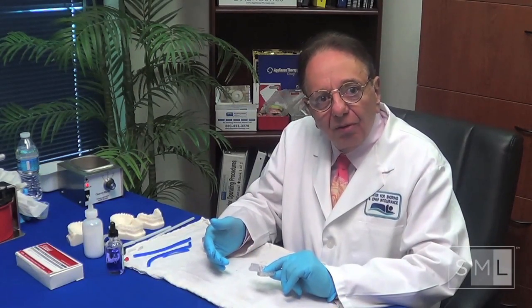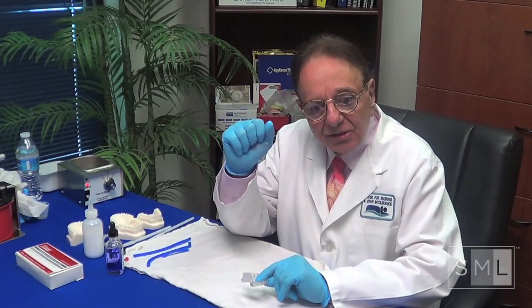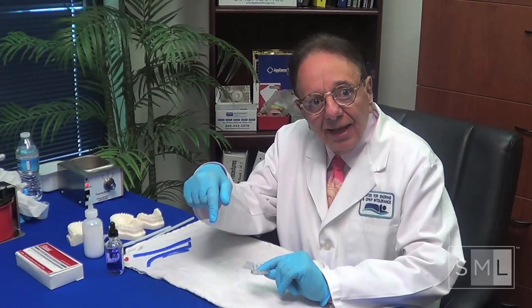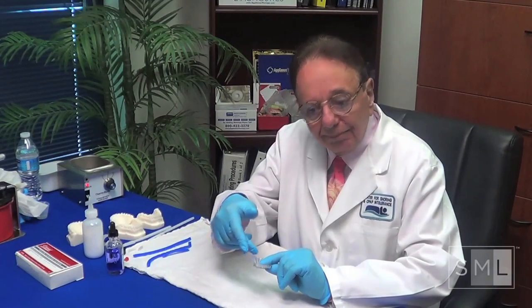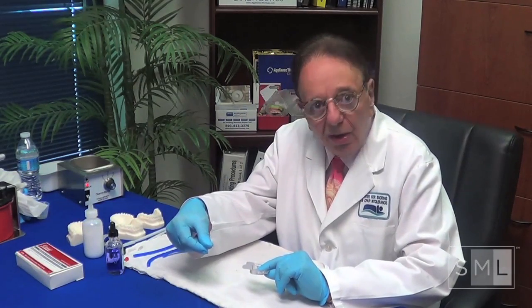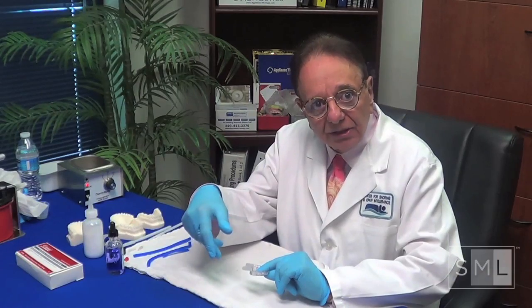First adjustment: we've added to the tail in length and depression. We try it in the mouth and the patient says great. We send them home for two weeks. So the first time we insert the mouthpiece, they get sent home for one week. Now they've come back, we've added the wax and acrylic, and now we send them home for two weeks. Some of them will come back saying it's bothering them — a very small percentage. We then make it smaller or lift it up. You know how to play the game: add more acrylic, let it harden, trim it at the lathe, trim with the handpiece, polish it. Piece of cake — send them home for two weeks.